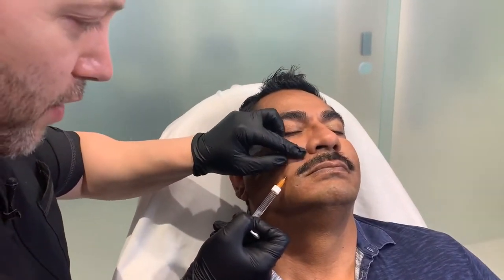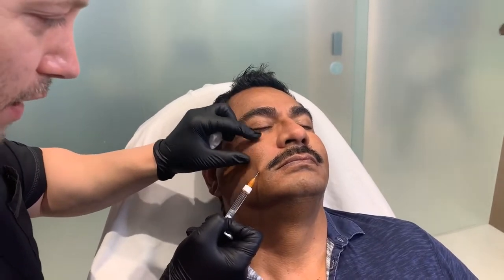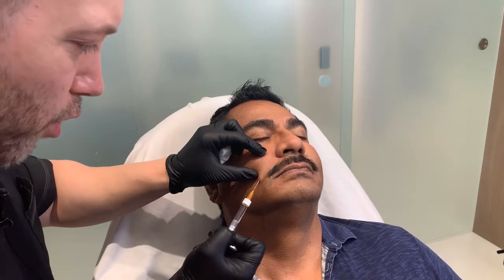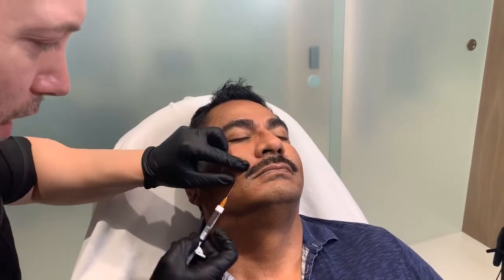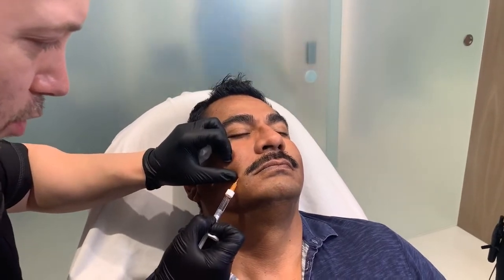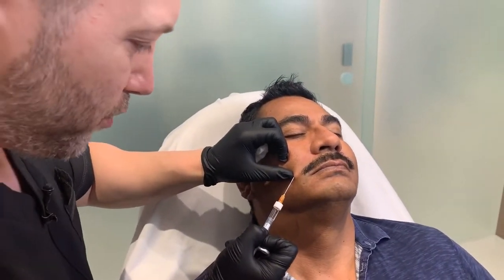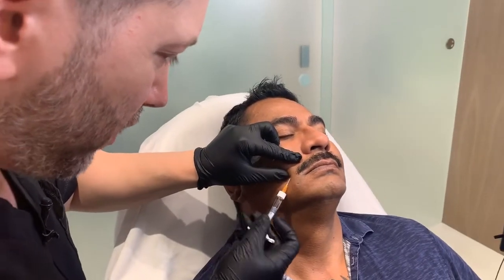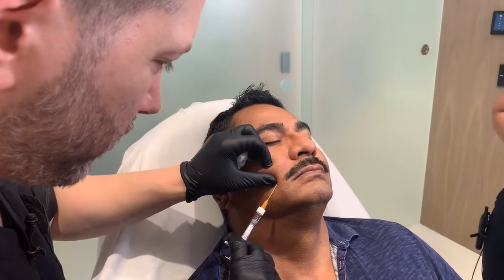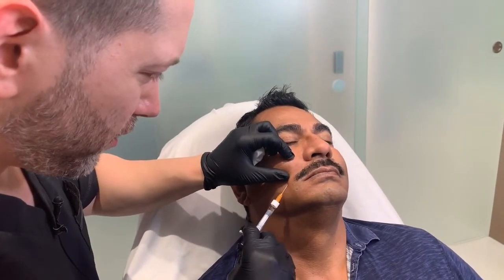Now, a lot of what is happening as we age, why we get folds, is because the cheek area tends to come down a little. But you don't want to overdo the cheeks. When he smiles, he actually has a lot of volume there. So our goal is to give him some volume directly in the fold. And Restylane, he likes from the past. It has a little more substance to it, and will hold this area for him pretty well.